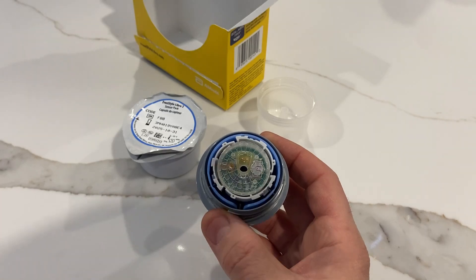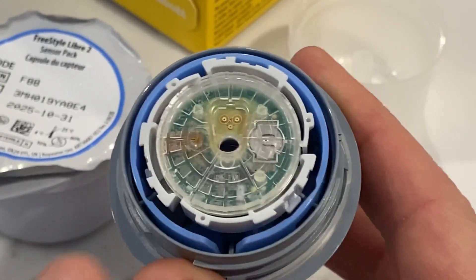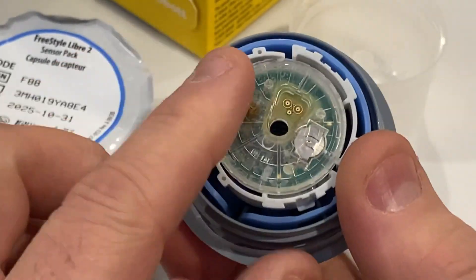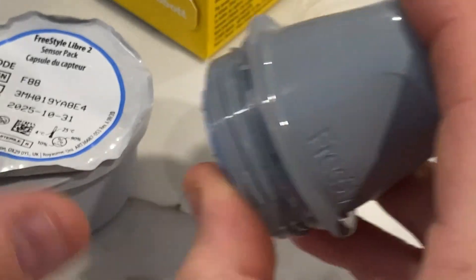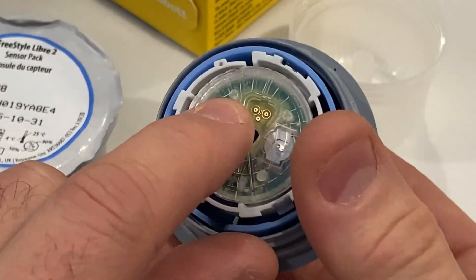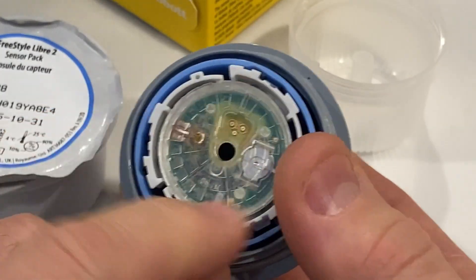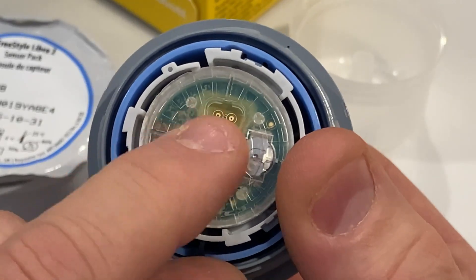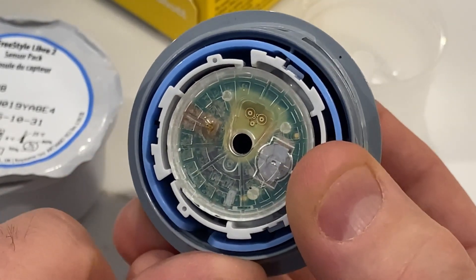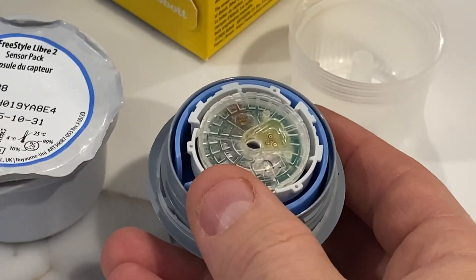I'll just zoom in here for a second so you can see. This is usually covered with a sticky material. What happens is you put it into this thing to pick up the needle — it picks up the needle and inserts into there, and then you stick it onto the skin. Those three contact ports there are the electrode; they somehow pick up the information from the needle.